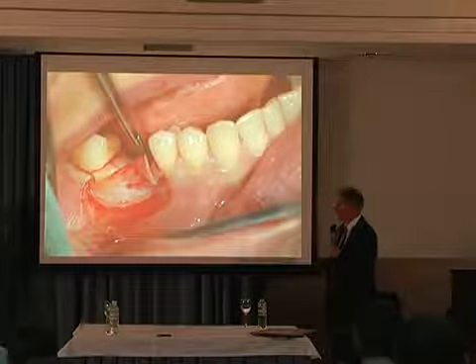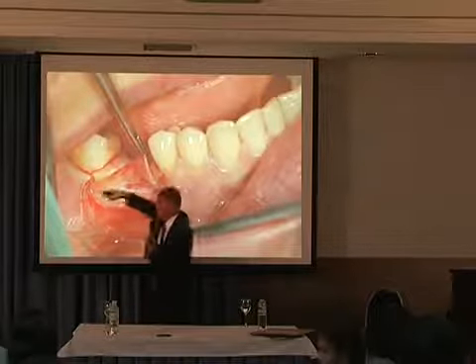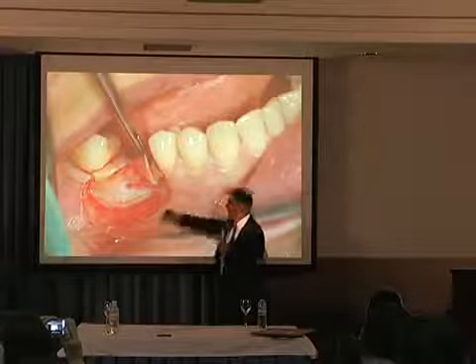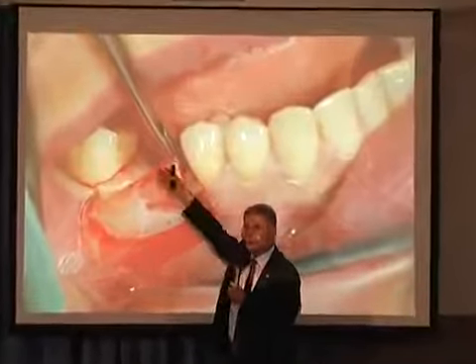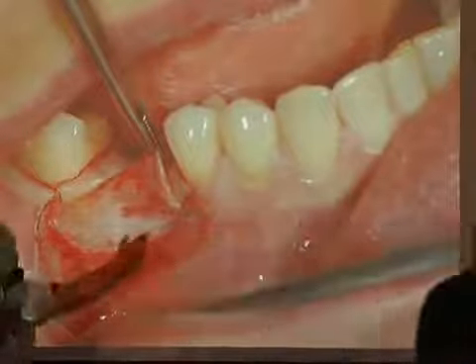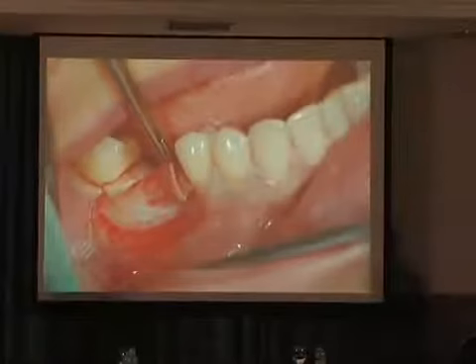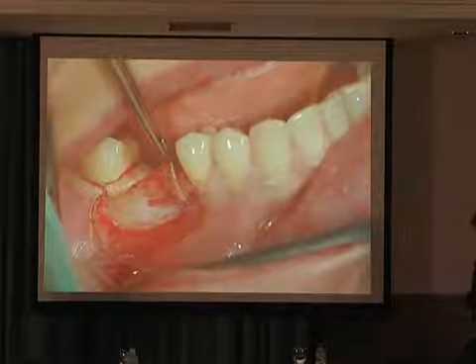Только слизистой оболочки. 4 millimeter down the alveolar ridge here, we cut the periosteum. На 4 миллиметра, отступая от гребня альвеолярного отростка, они разрезают надкостницу. We have then a periosteal tunnel here apically and a full mucoperiosteal flap later to cover our splitted area. И вот начиная от этой зоны 4 миллиметра и до язычной поверхности, они имеют полный лоскут мягких тканей и надкостницы. Здесь ниже у него только мягкие ткани.